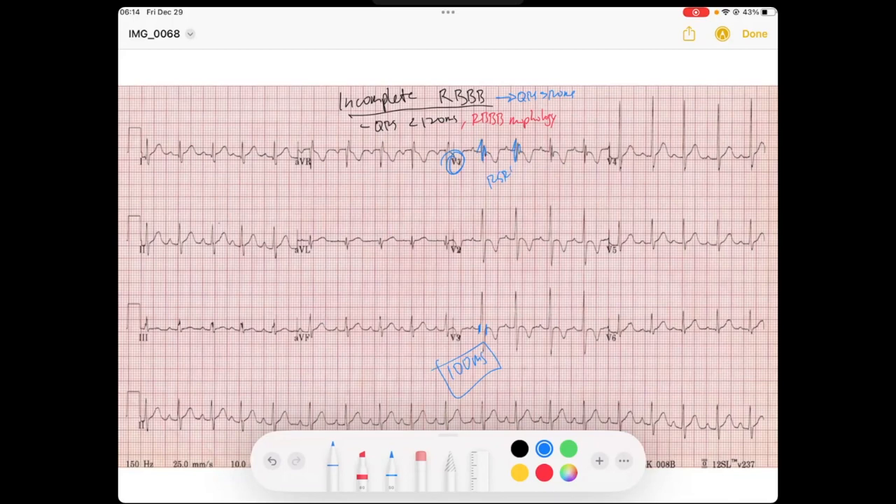R prime in V1 means we have late positive forces towards V1, which means late positive forces towards the right ventricle — which is common in what you would see in a right bundle branch block. But we know the right bundle branch is not completely blocked because the QRS is not wide; it's just partially or incompletely blocked.